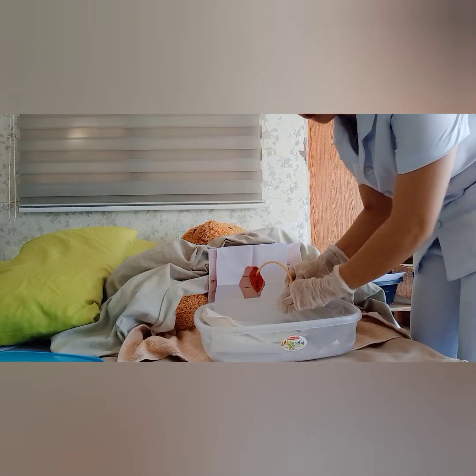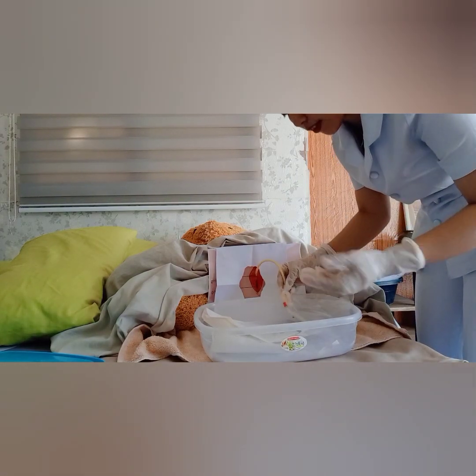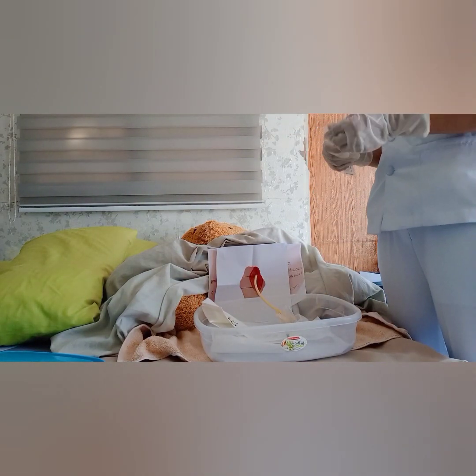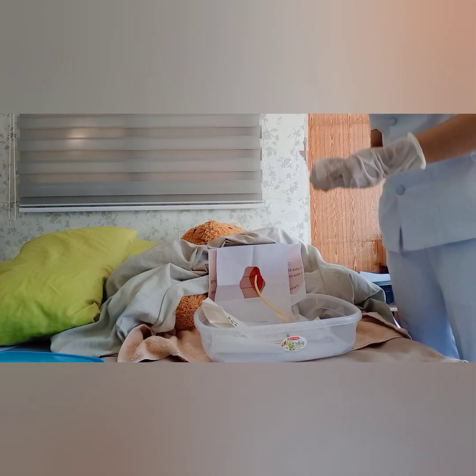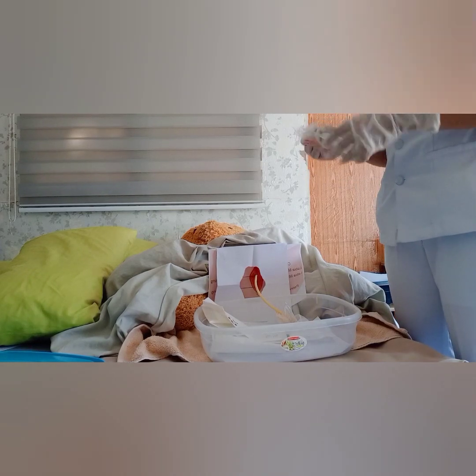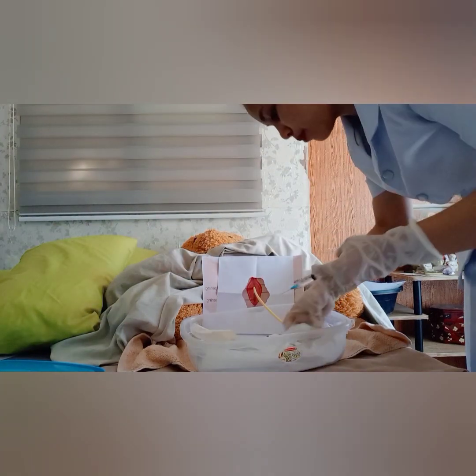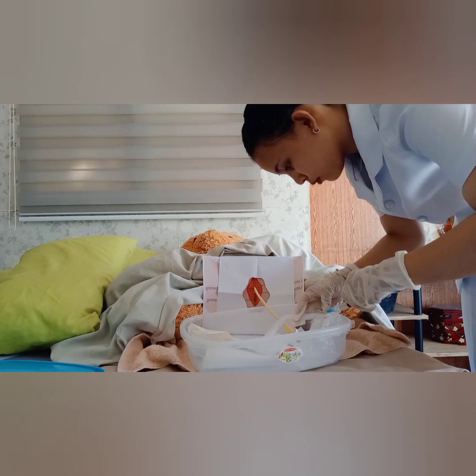So inflate the balloon with 10 to 15 cc of sterile water using a 15 to 20 cc syringe. I have my syringe now. And I will get my sterile water. So the next thing that we're gonna do is insert our sterile water. Okay, done.